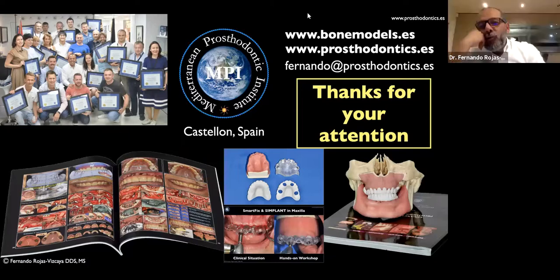So I try to set the teeth first using all numbers as reference, and then try to create an occlusion that is protected, canine guidance. So according to the movements, I make sure that the case is working. So you want to create the specific area where the patient can have a correct guidance for disocclusion. But no, I don't give any specific number. It's during the process, when you are doing it, you will see.